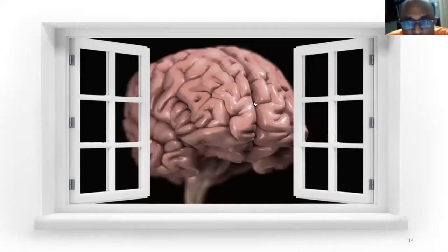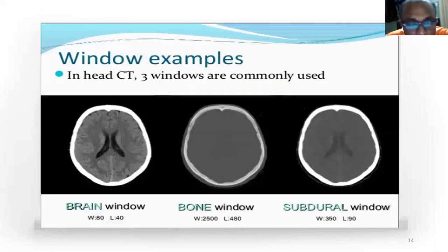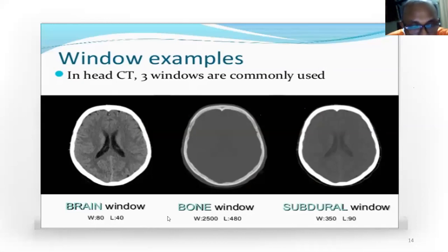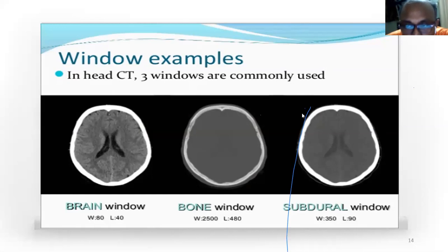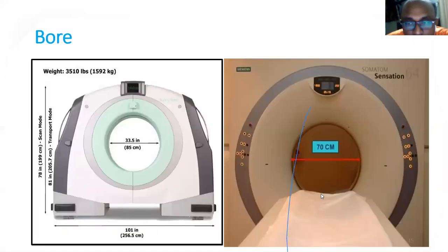For brain windowing, there are three important windows. The brain window has a window width of 80 and window level of 40. The bone window has a window width of 2500 and window level of 480. The subdural window is mostly useful for injuries and less important for stereotaxy planning.